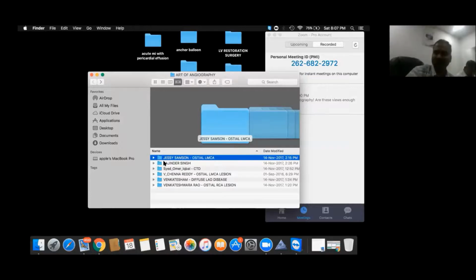That's what I do many times, because sometimes you spend a lot of contrast just positioning the stent in ostiums. Sometimes you will take 5 to 10 views. So IVUS will minimize your contrast usage, and it will maximize your capability to locate the ostium. You can use IVUS to locate the ostium, and in the same view you can deploy your stent.